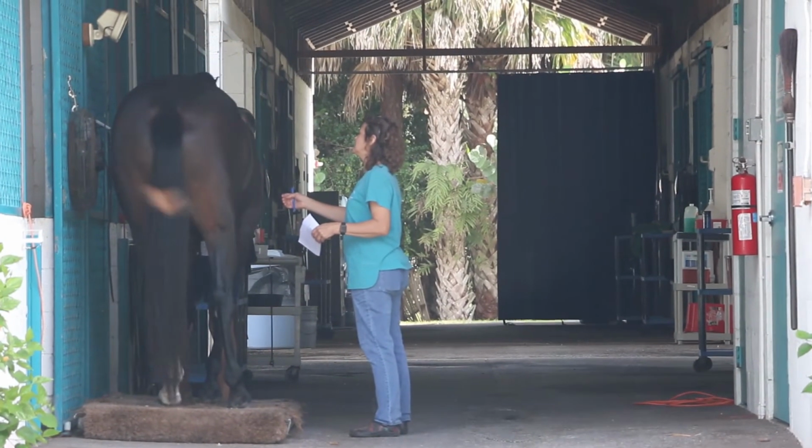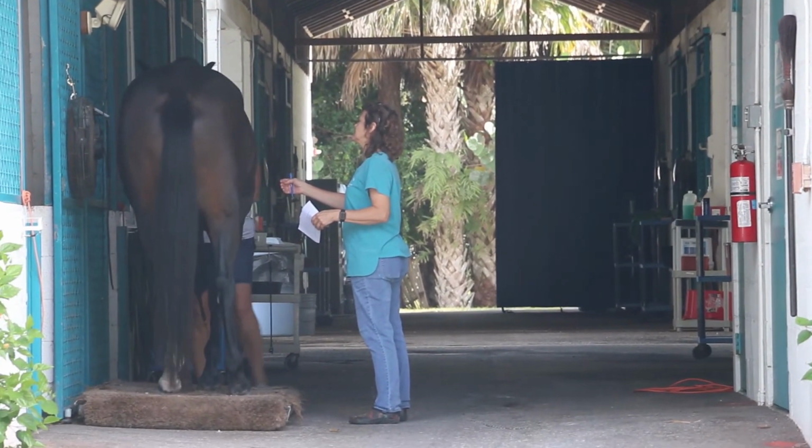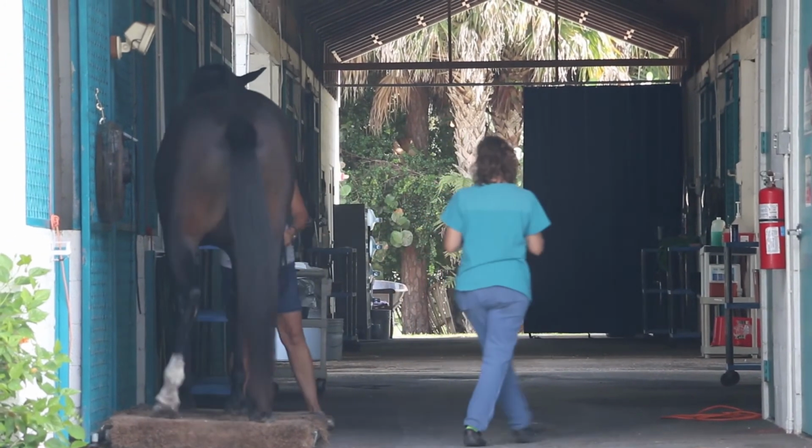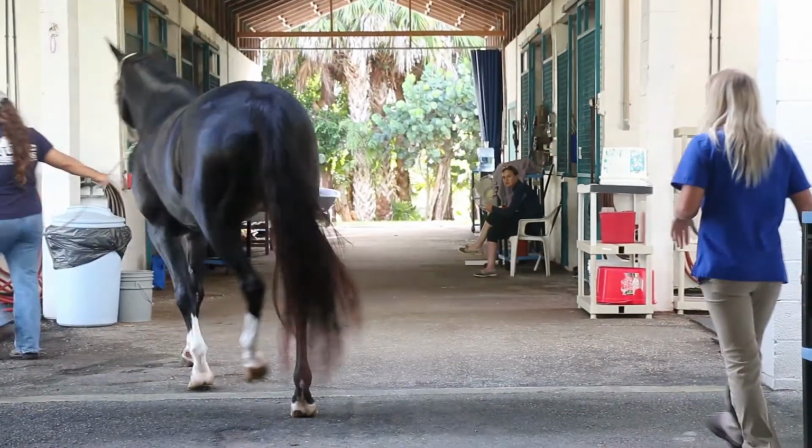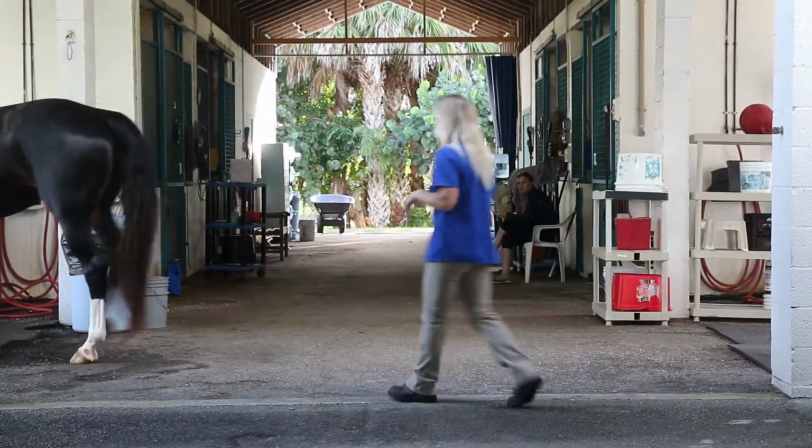In terms of training and prepping horses to come in the chamber, the entire preparation is to prevent any possible sparks from happening in the chamber. And they have to keep fuel and accelerants out of the chamber. So that means no fly sprays are going to be allowed on the horse, nothing volatile, nothing. And humans, we do the same thing.